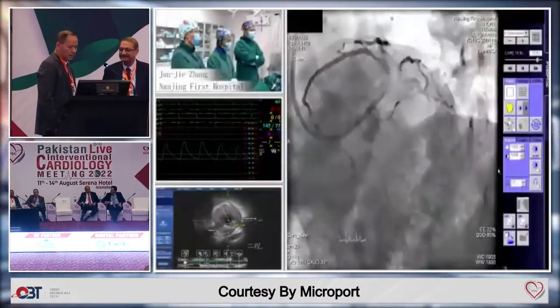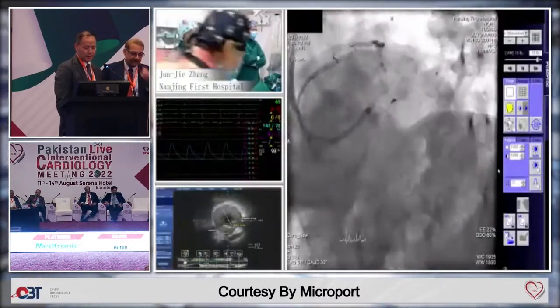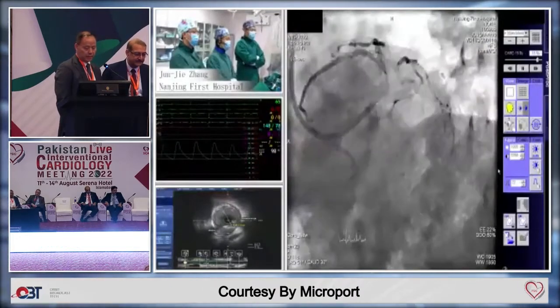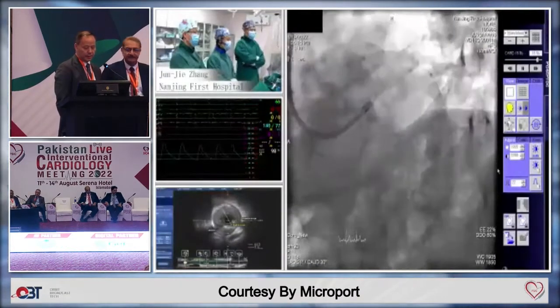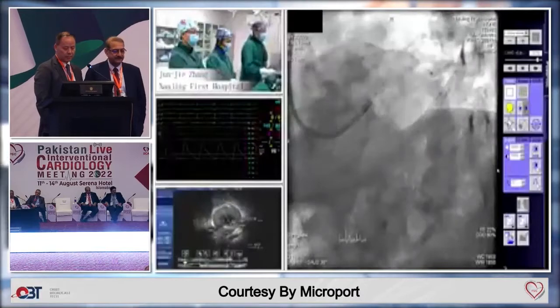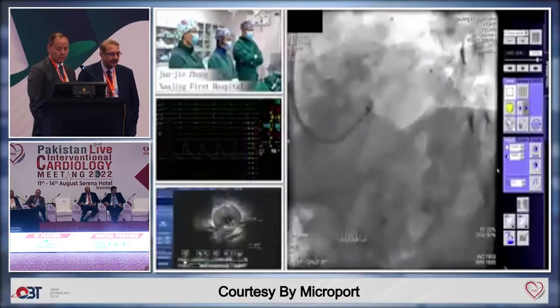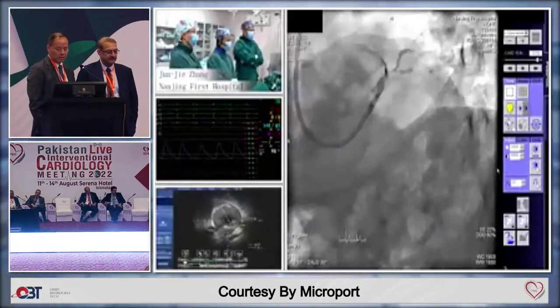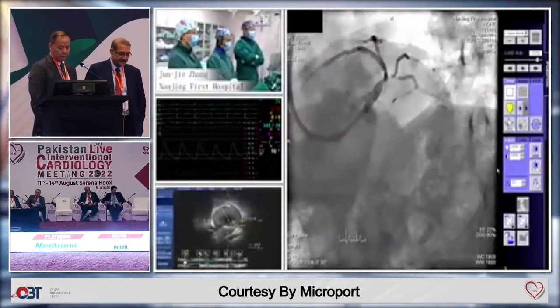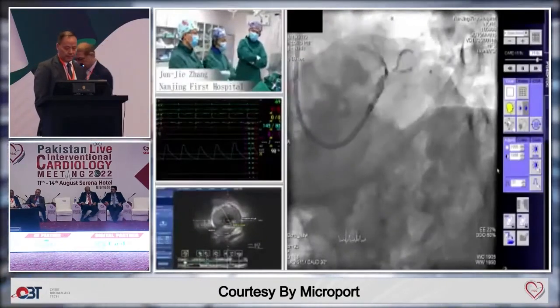Thank you. Angiography is now zoomed in, so clearly there is mild to moderate calcification at the proximal circumflex. So Jun-Jie, do you plan to pre-dilate the circumflex and then check IVUS first? Yeah, Prof. Actually, we didn't do the predilation. According to the strategy pre-decision, we performed the IVUS evaluation. So let me let Dr. Pan introduce the baseline IVUS from the LAD, OM, and the circumflex. So please, Pan, introduce the IVUS.